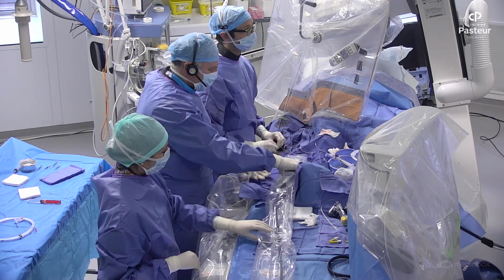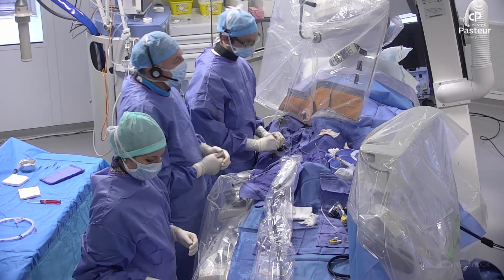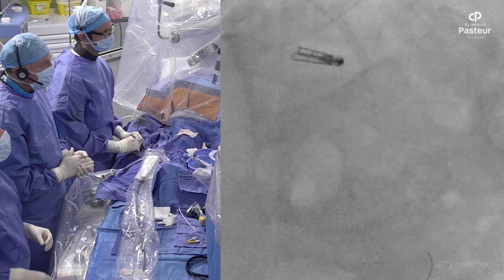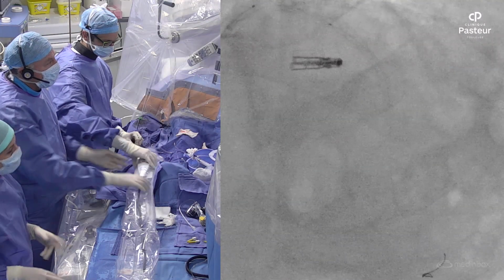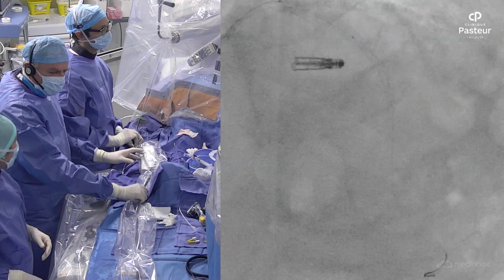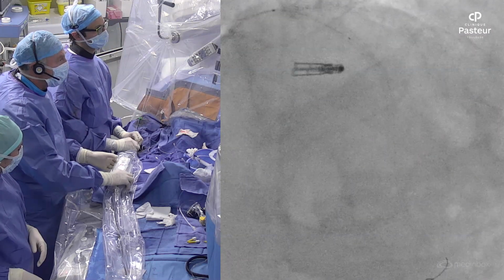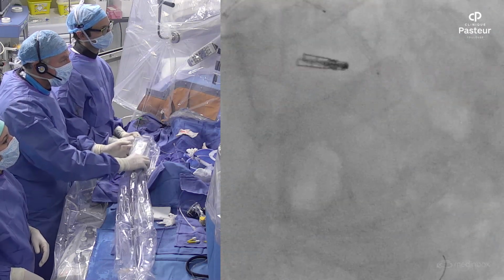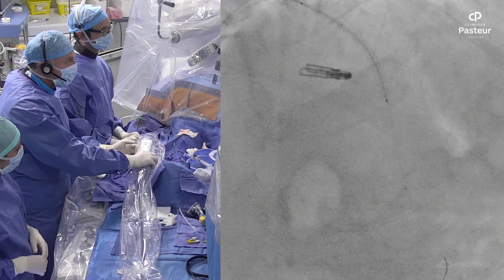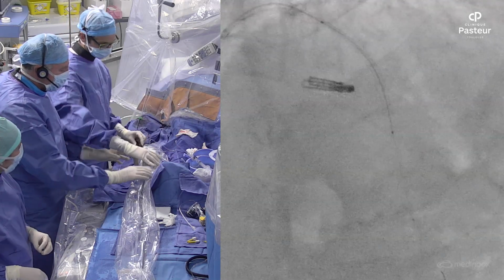Okay. So we will go for OCT. We'll do the OCT now. So we follow our initial strategy, except that we have done just a provisional strategy, doing a kissing. But now what we want is to evaluate the final result and to be sure that the stent is well opened, well apposed. Okay. Is it enough or a little bit more? I think it's okay.